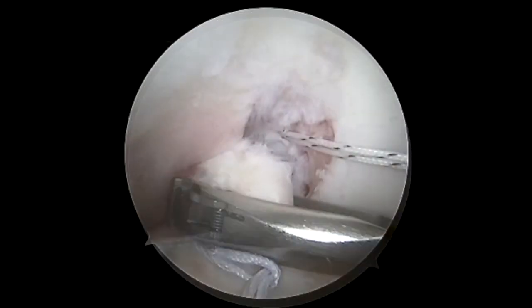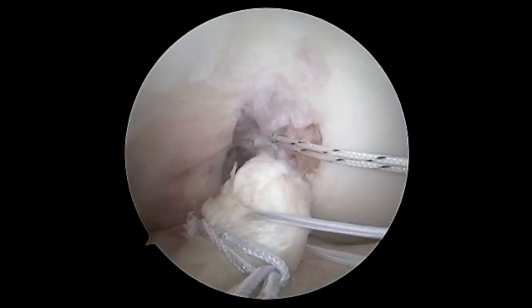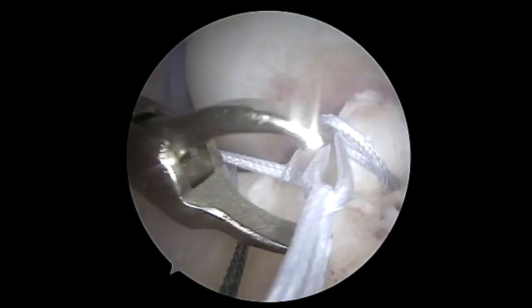We're using a shoulder scorpion here to get better bites. We take a bite from each side — the lower bite out the medial portal and the higher bite out the lateral portal. This allows for ease of passage.